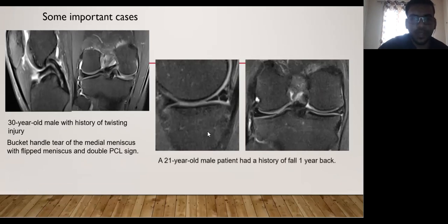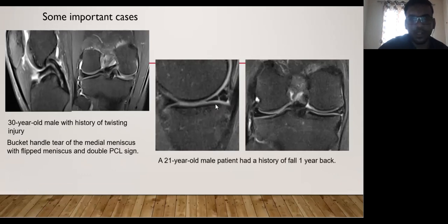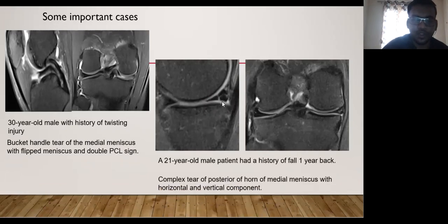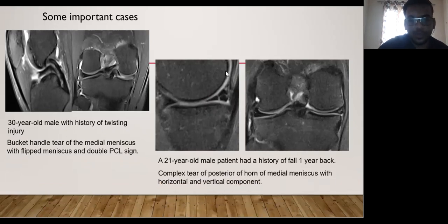Next is a case of a 21-year-old male patient who presented after a history of fall one year back. On the sagittal and coronal PDFS MRI sequences, there is injury involving the medial meniscus, particularly the posterior horn. This is a complex tear with two components — a horizontal and a vertical component. Complex tears usually do not have a specific appearance and can have different components, as seen in this case.